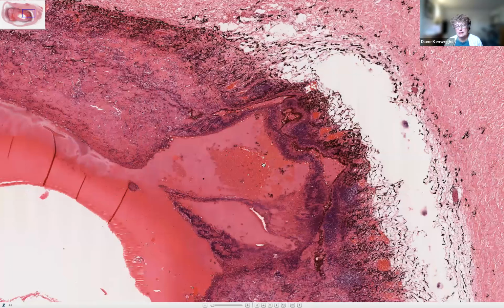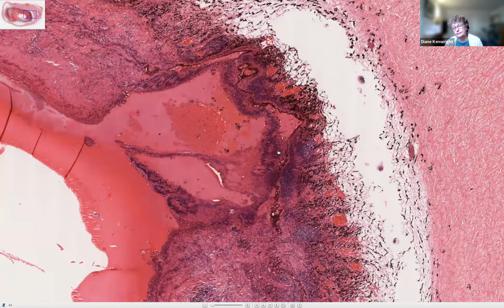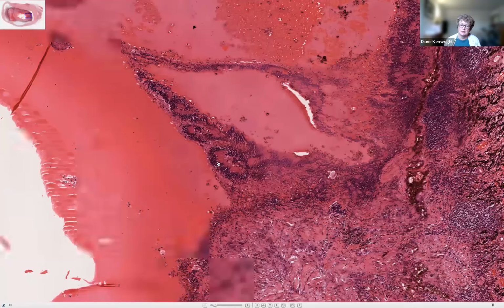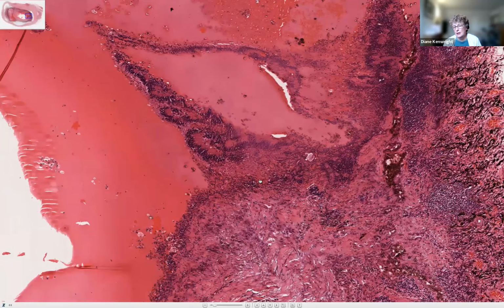This retina, well, it's clearly detached through here because we've got a bit of subretinal exudate. And then as we go closer, we can see that the retina is quite disorganized in places. Here it's forming these weird little rosettes, so it'll be damaged, and when retina becomes damaged, it undergoes gliosis. So it's fairly safe to say that there is gliosis. Okay, moving backwards a bit, again we can see the RPE layer as we come around.